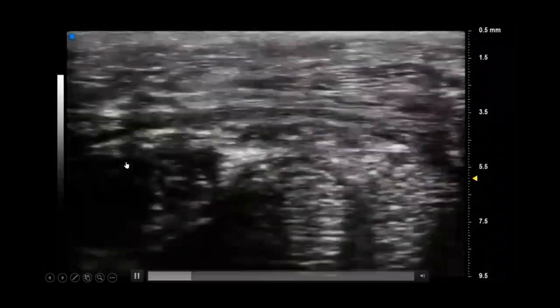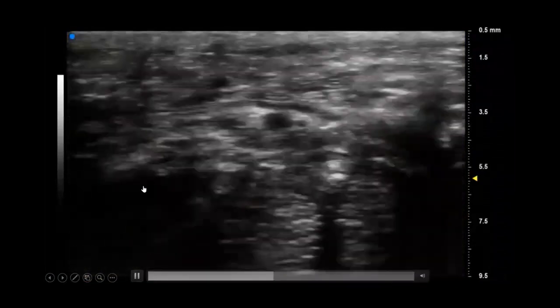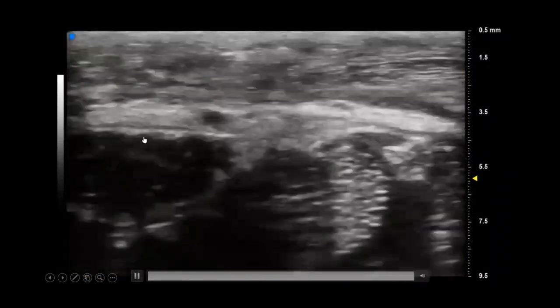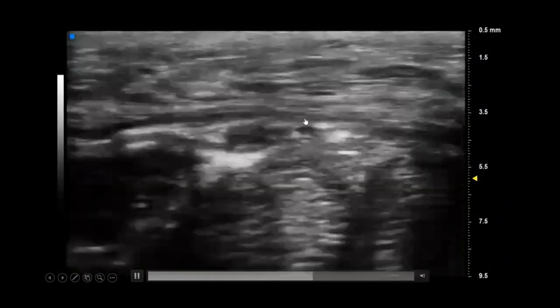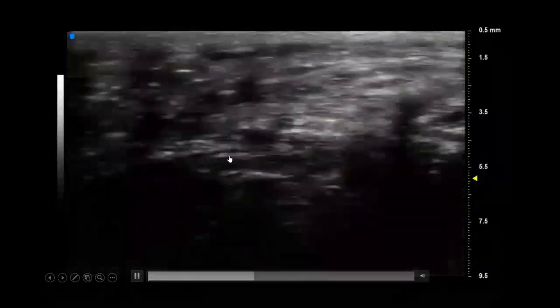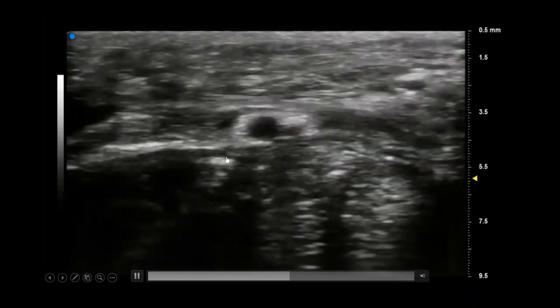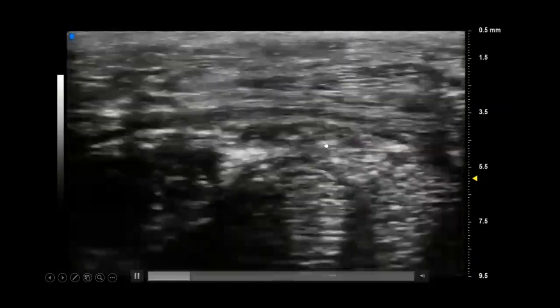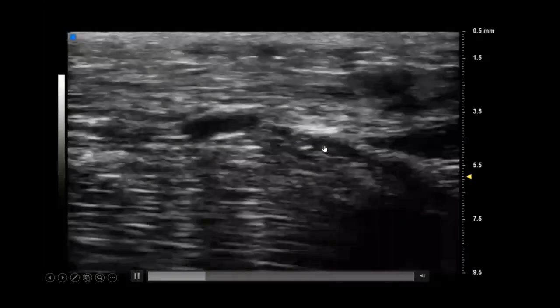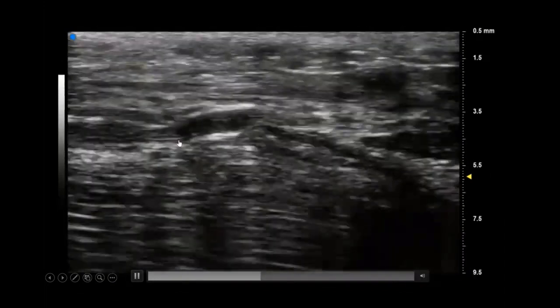Again, this is a high resolution ultrasound image. The thenar motor branch is coming off proximal to the carpal tunnel, then traverses through the transverse carpal ligament. Doing an ultrasound guided release in this case would potentially lead to injury to this nerve and therefore be inappropriate. Here, this video shows the nerve coming up through the transverse carpal ligament.